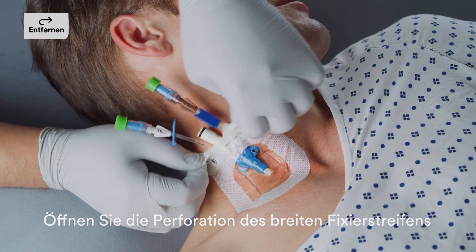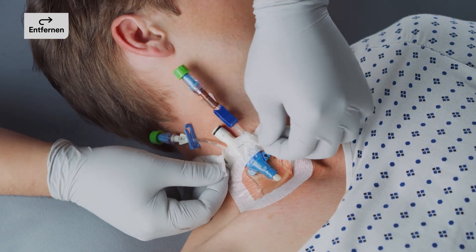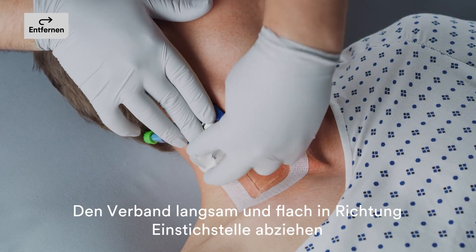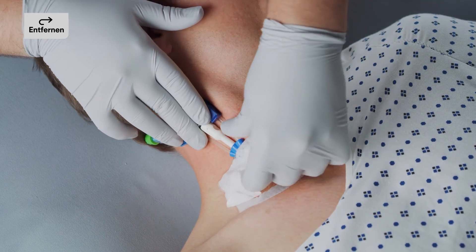Open the securement tape strip perforations. After opening perforations, hold the securement tape strip and peel back the dressing toward the catheter insertion site using a low and slow removal technique. Avoid skin trauma by peeling the dressing back rather than pulling it up from the skin.